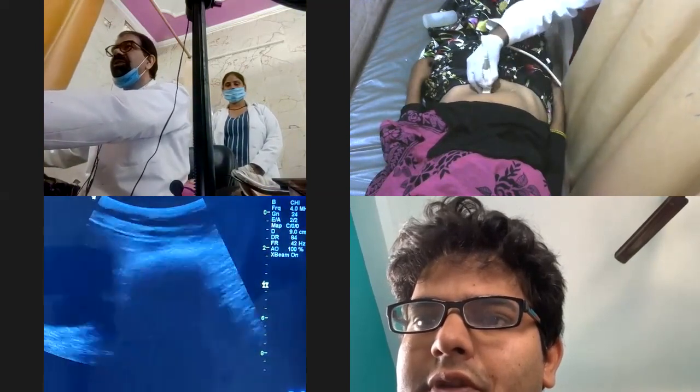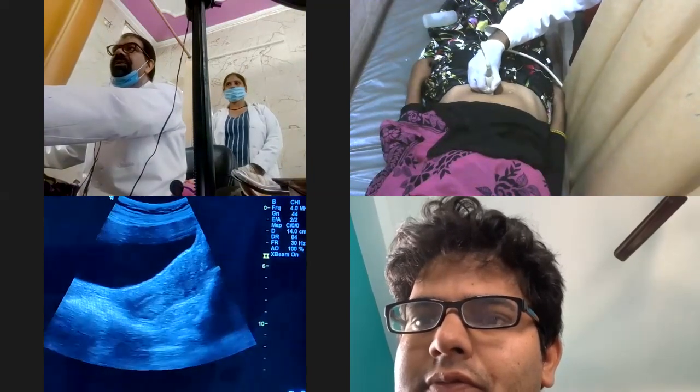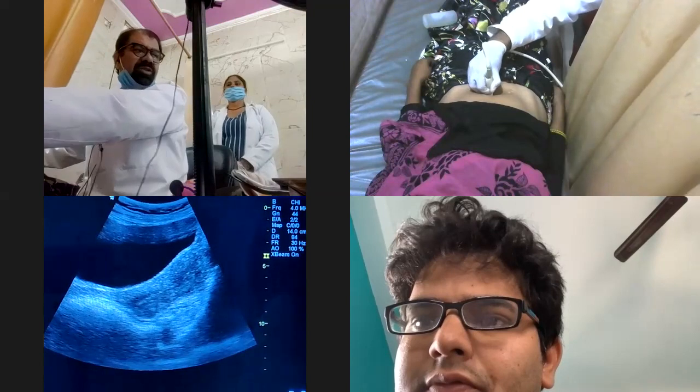We will discuss this in great detail with multiple patients. You control your background noise. There should be no background noise over there.